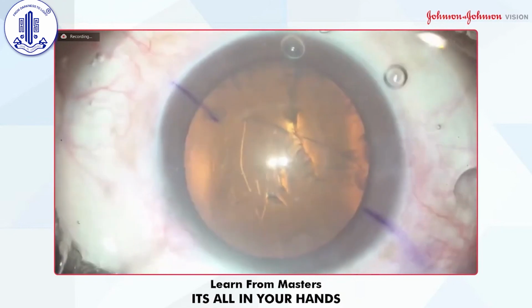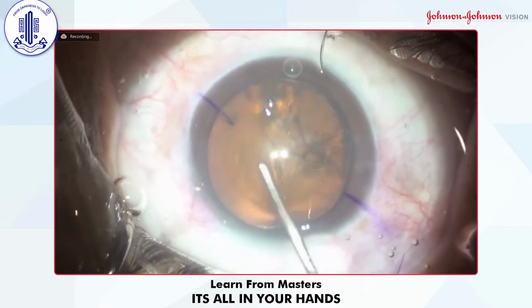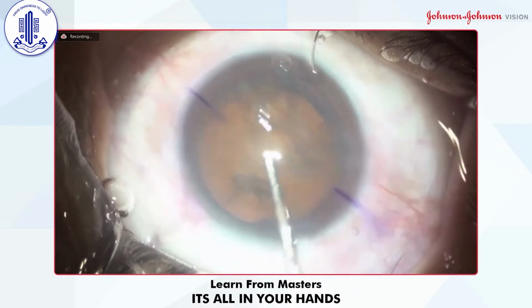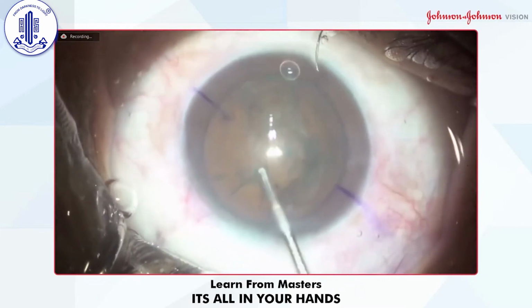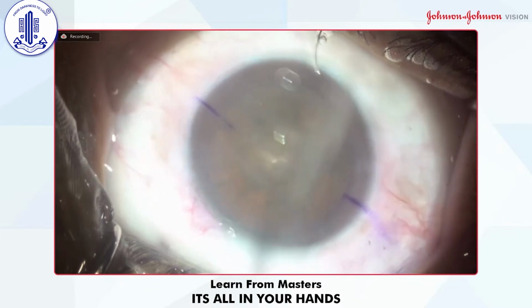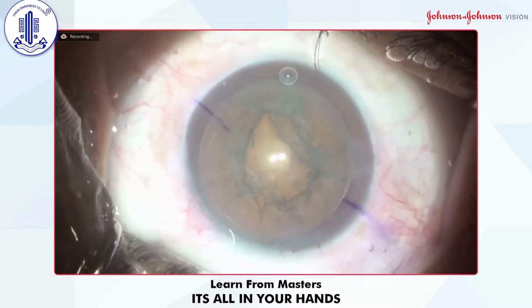Viscoat is there, next case. This axis. So this is a hydro. If you feel like you can do hydro dissection also and hydro delineation. And as I told that between all the steps, I inject viscoelastic.